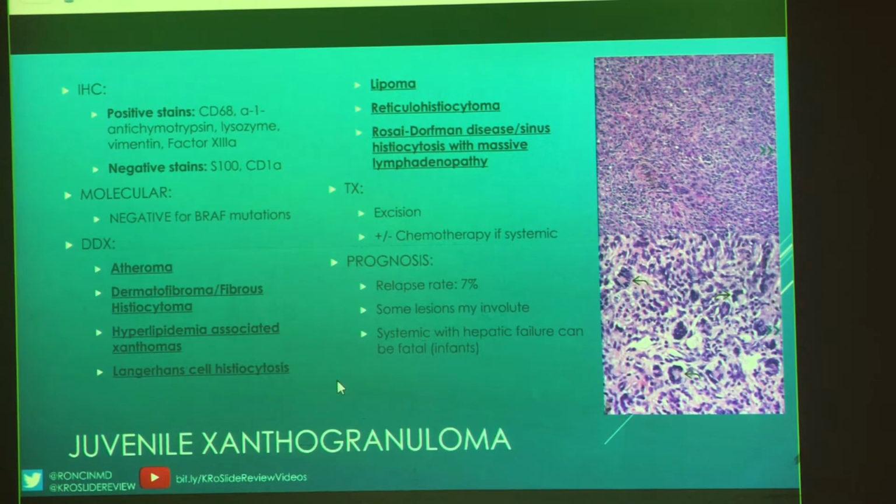Well, when you look at the differential, it's more important when you're looking at things like your Rosai-Dorfman, your reticulohistiocytoma, Langerhans cell histiocytosis. So again, that negative CD1a is going to help you determine that this is not Langerhans cell histiocytosis, and again, LCH is a lot more common than juvenile xanthogranuloma.